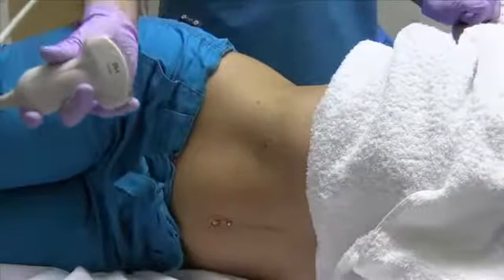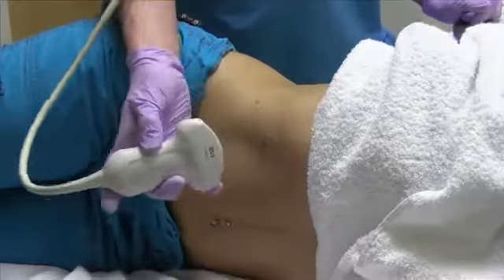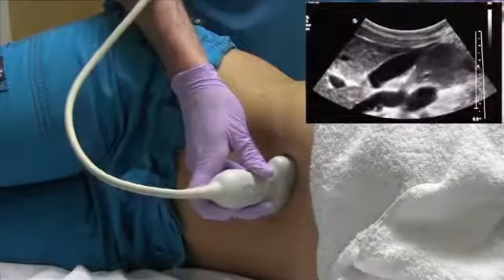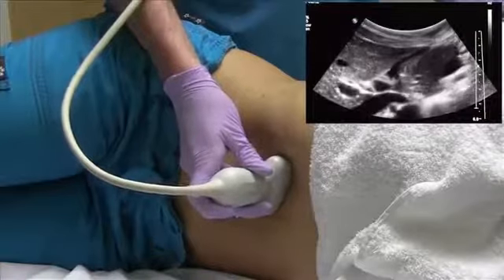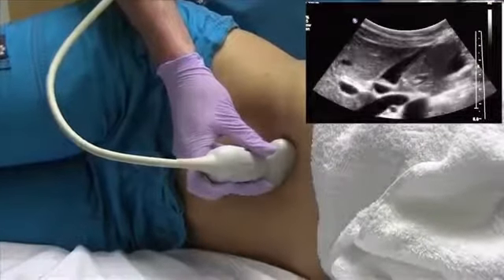You have the patient turn on their left side away from you, and that usually brings the gallbladder forward here. So we're going to come subcostal and sweep through, and you should see the gallbladder very anterior here. I like to start in a sagittal plane from here.